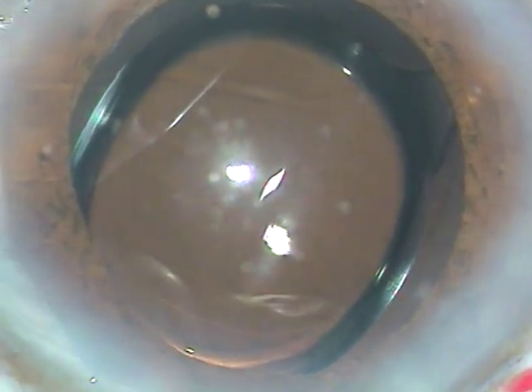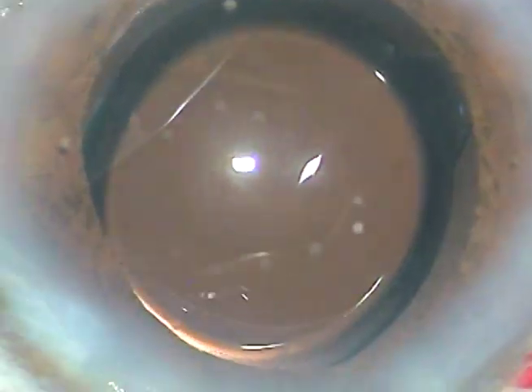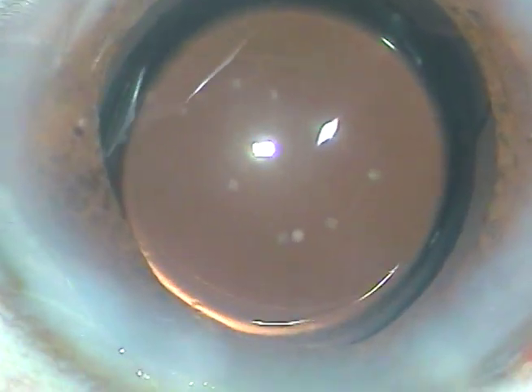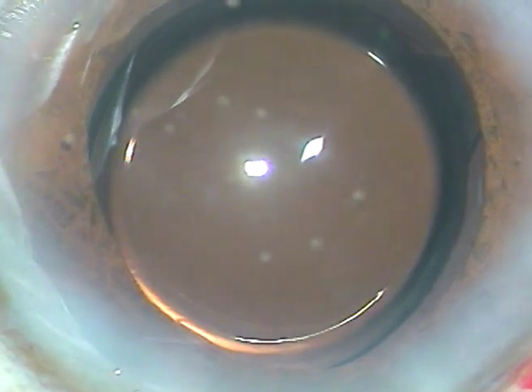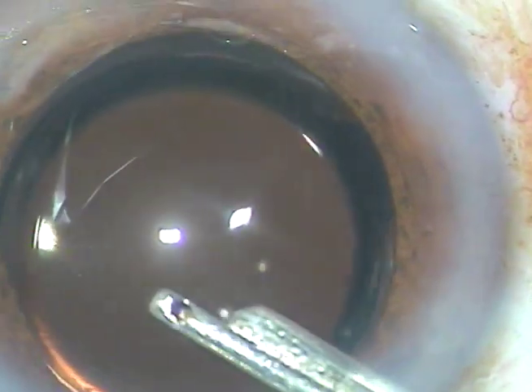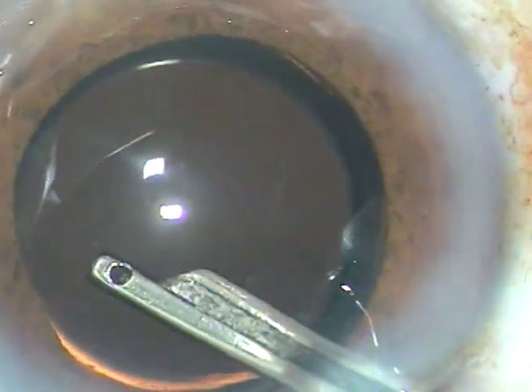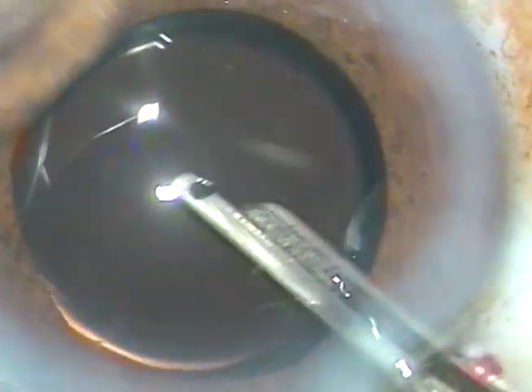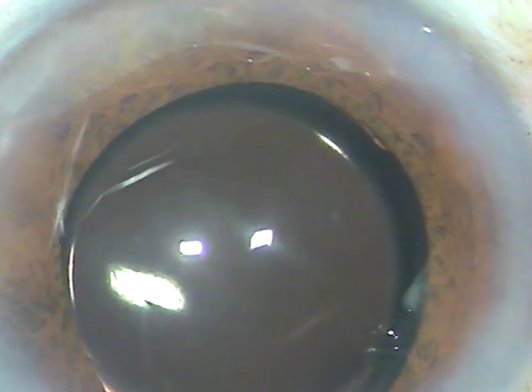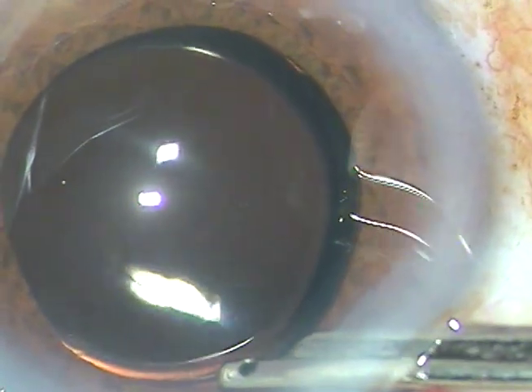This is a bit of moxifloxacin. The side ports are hydrated now with BSS so that these stab wounds become waterproof. A final lavage of the anterior chamber is done with pure BSS to remove any particulate matter. Viscoelastic that sticks to the corneal endothelium is also removed. The anterior chamber is formed and the case is concluded.